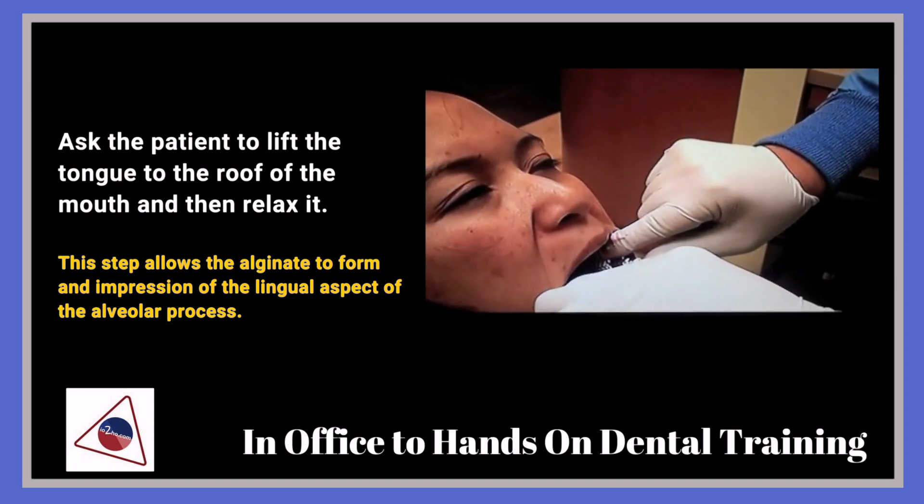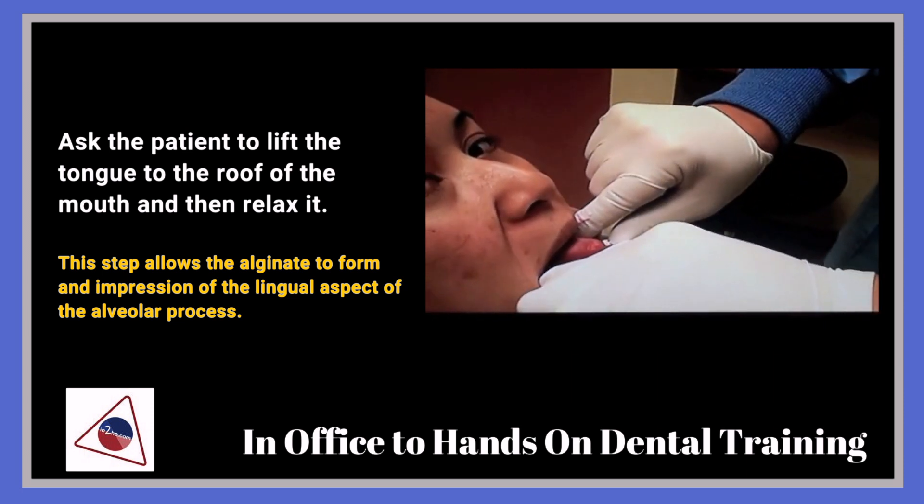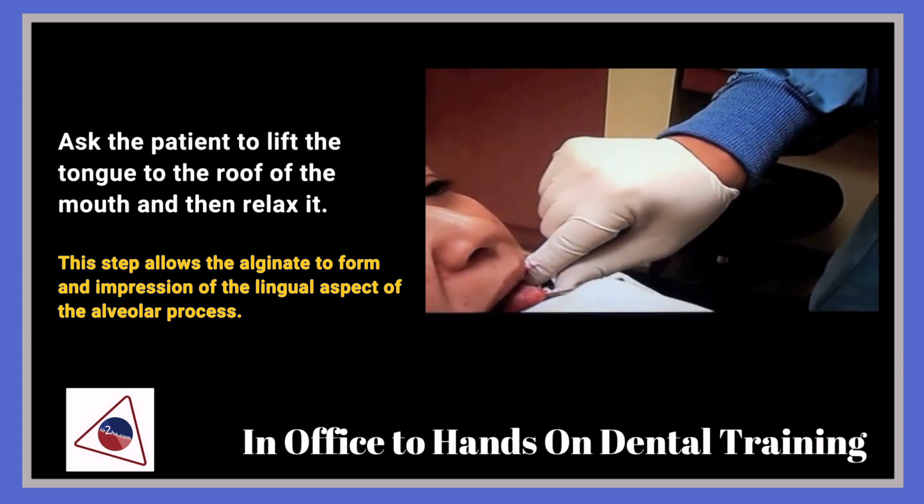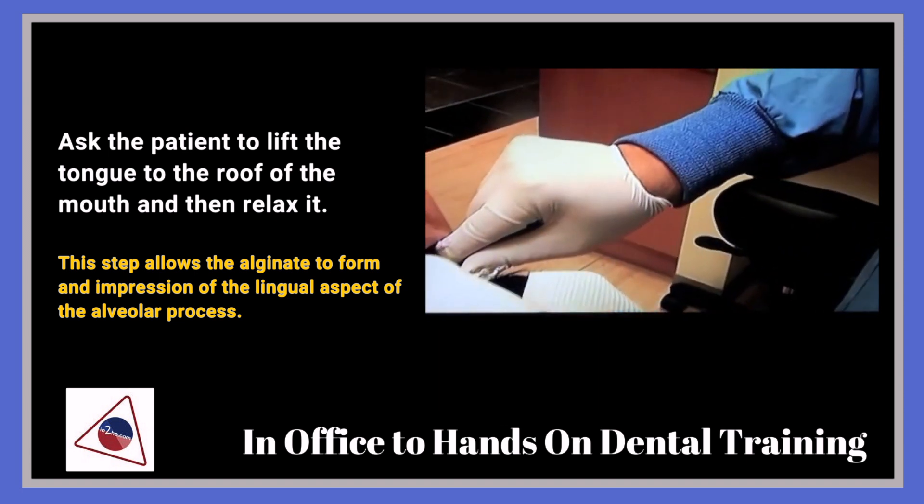Have the patient go ahead and stick their tongue up. Hold it both right and left on the posterior side, and just hold it there until the material sets.